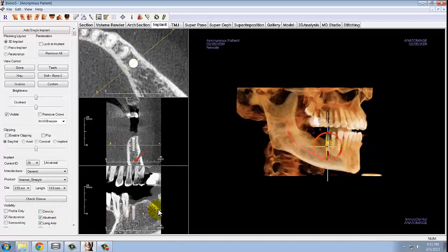This additional cross section shows you the mesial-distal relationship of that implant with the adjacent teeth. Here, you can also click and drag the implant to move it bodily, as well as click to turn on the red wheel to adjust its mesial-distal angulation as well.